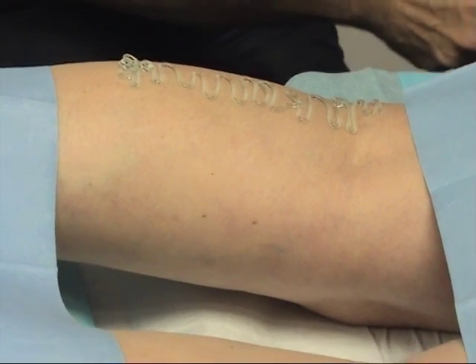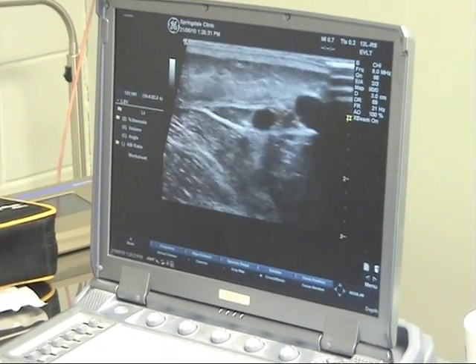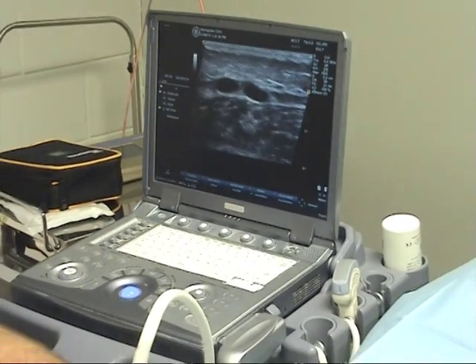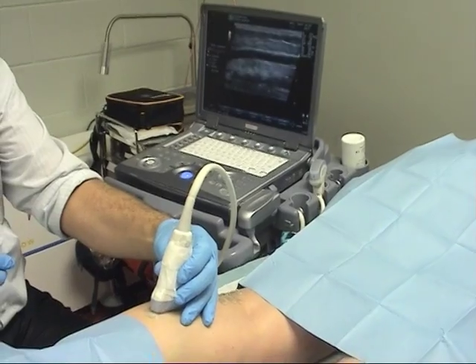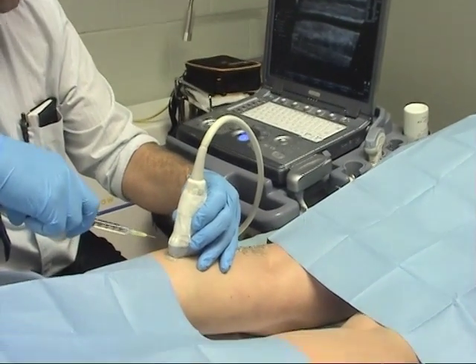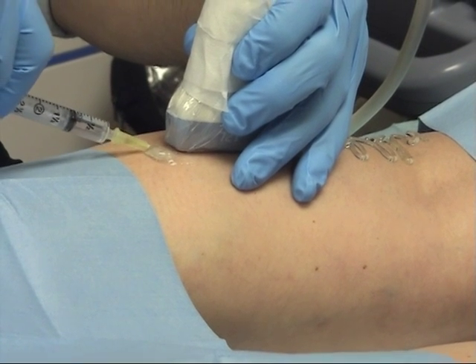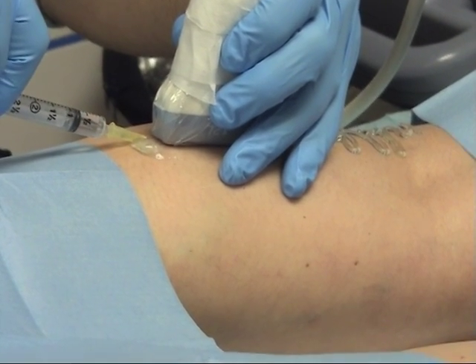You won't feel the same sting because it's away from the skin surface. Okay, just having a look again so we get the positioning right. A little bit of a sting just with the anesthetic, just to numb the skin surface. I'll do it slowly so that you don't get that much.